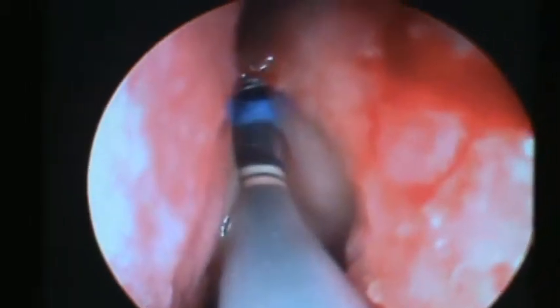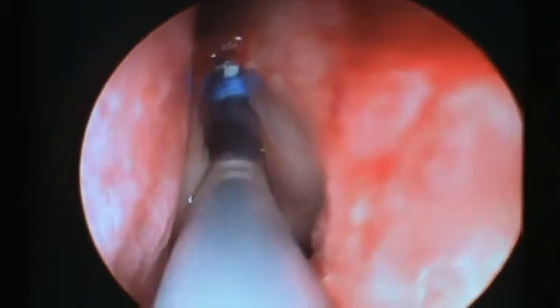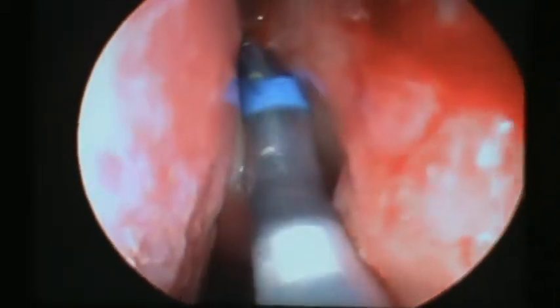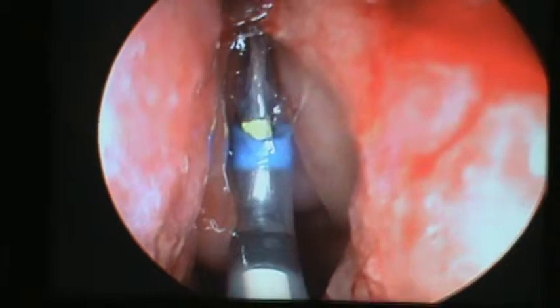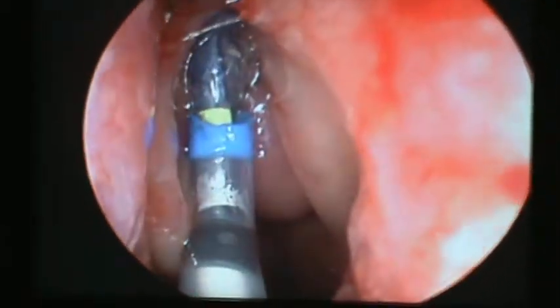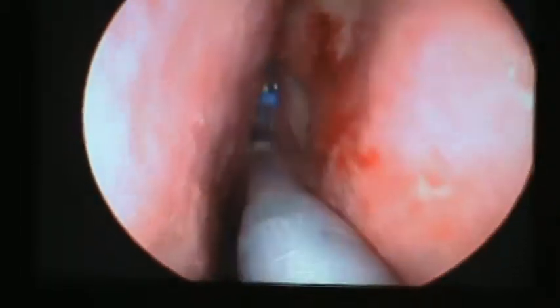Inflate, please. Alright Rachel, here we go. A little bit of pressure. Very well. Down. No pressure. 12. Down. Very good.